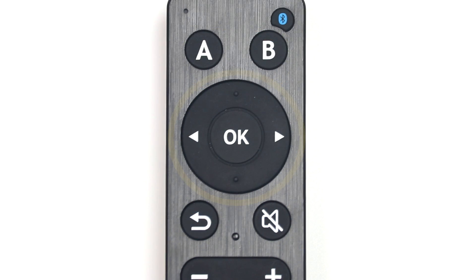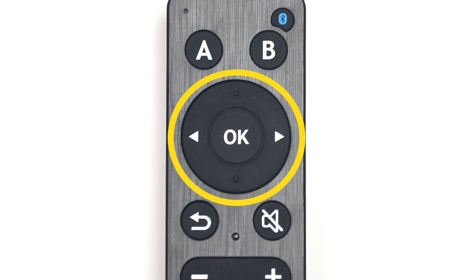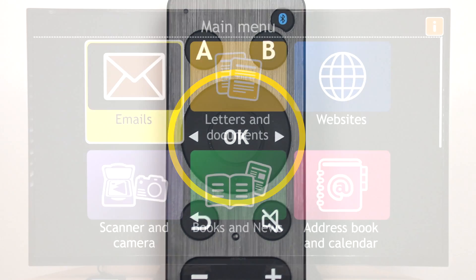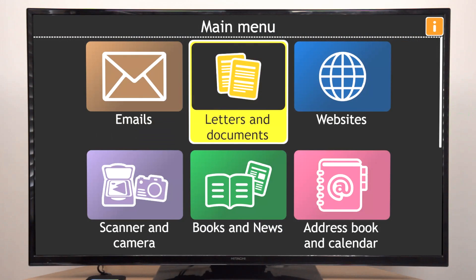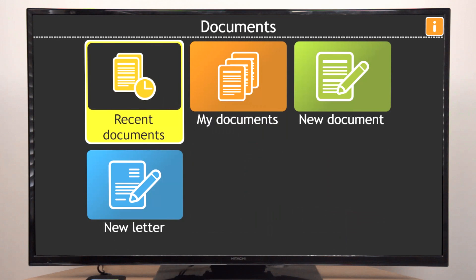The first group is the large circular pad in the middle. This allows you to move through the items on screen and select the one you want.